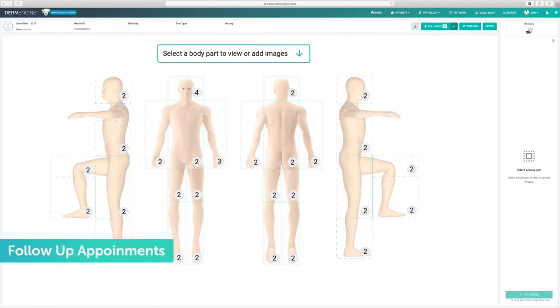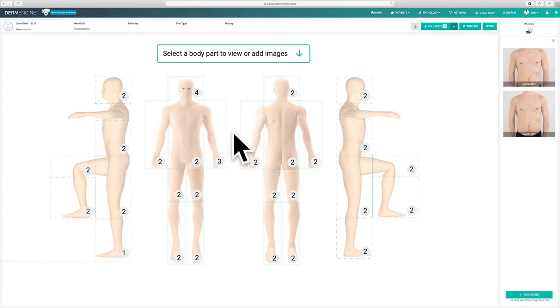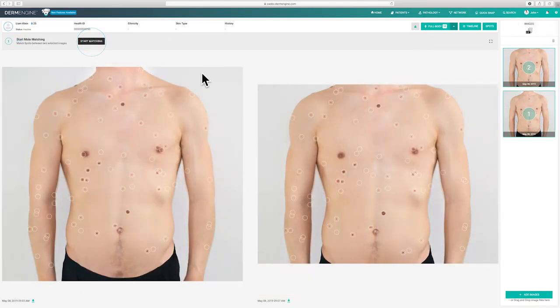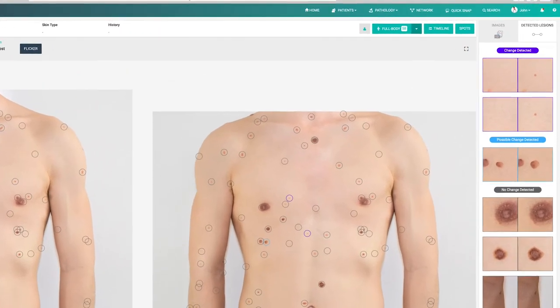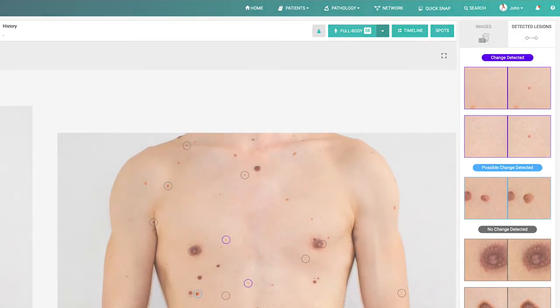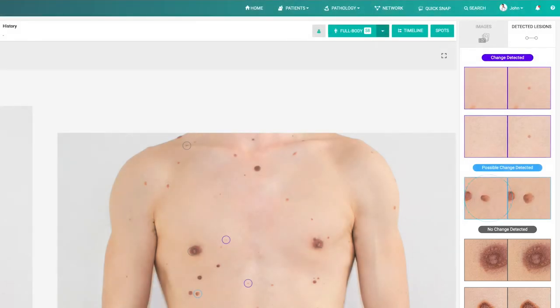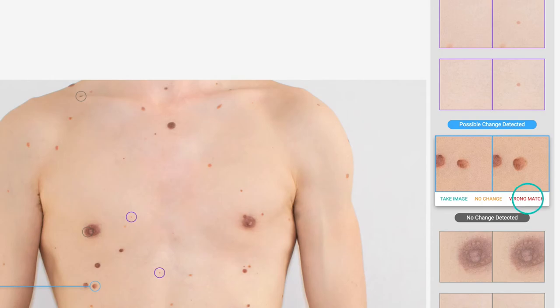For follow-up appointments, you can now compare images and use lesion matching to automatically detect any changes. To begin matching, click the desired body section, then select the images you would like to compare and click start matching. All detected lesions will be paired in the viewing column on the right. These will be sorted and color-coded based on the amount of change: purple for change detected, blue for possible change detected, and grey for no change detected. From here, you have the ability to review the list. Clicking an image will provide you with the following three actions: take image, no change, or wrong match.